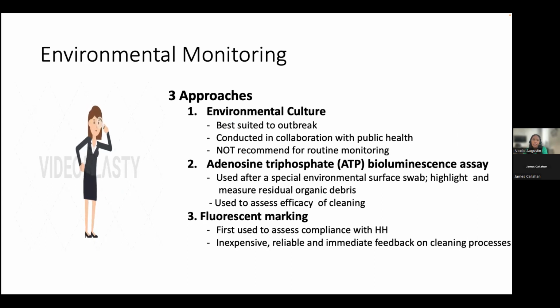Environmental monitoring. There are 3 approaches.